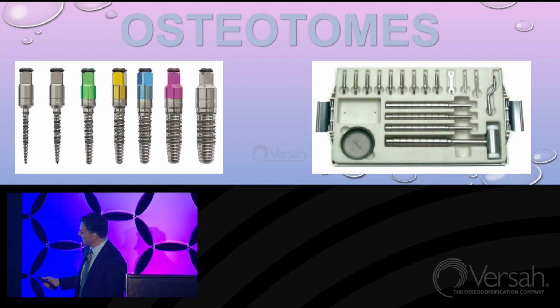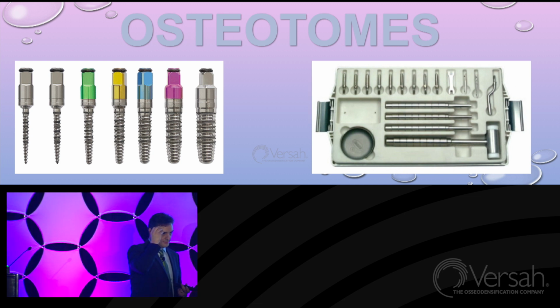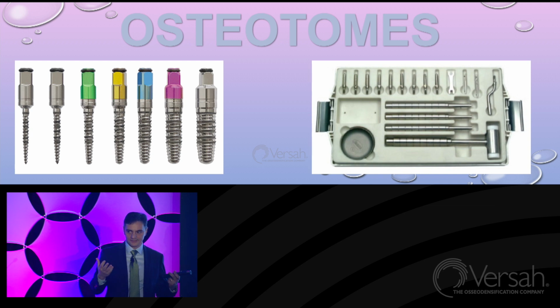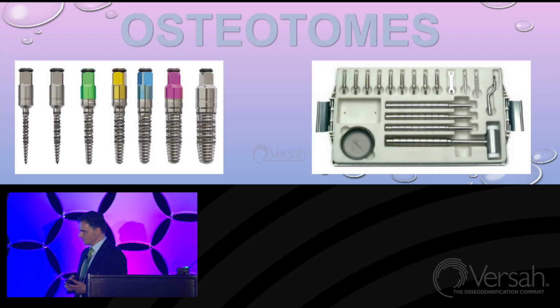This is another type of osteotome that I don't like, because I can imagine being in the head of my patients, feeling the hammer in the head. I cannot do this. I did it sometimes, but I really hurt myself to do this.